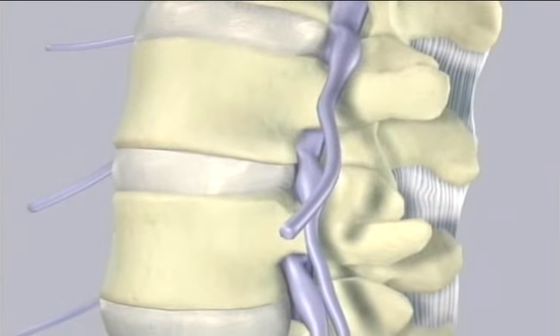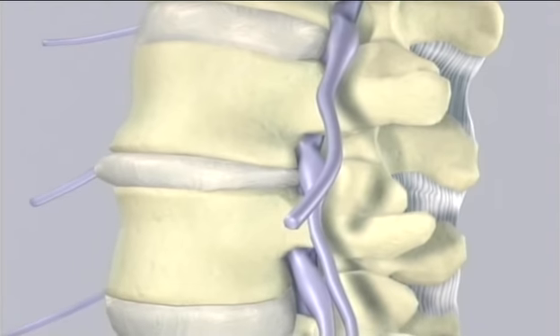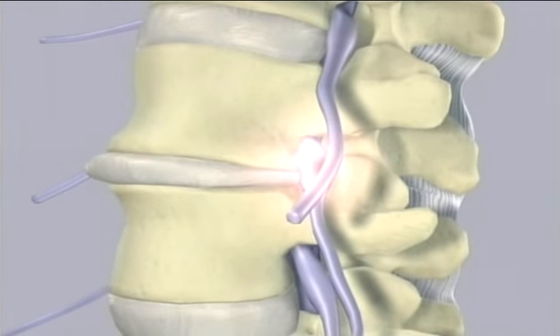We're going to be doing a procedure that is quite novel. It's for lumbar spinal stenosis, which is a condition where the nerves going down the spine become narrowed and causes compression of the nerves. The patients who typically present with the symptoms with this condition are ones who have difficulty walking, they have difficulty standing in one position. Typically these are the patients that you'll find at the grocery store. They're kind of hunched over a shopping cart trying to get some relief of pain. And these are probably the patients or the subset of patients that would benefit most from this procedure, which is called XSTOP, which is a minimally invasive way of treating lumbar spinal stenosis.